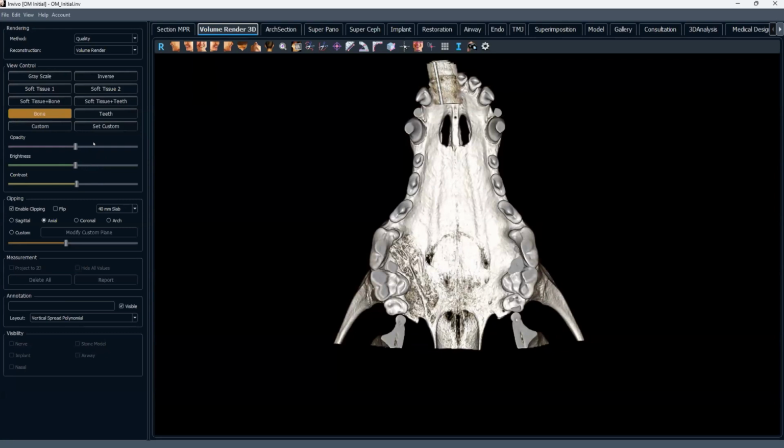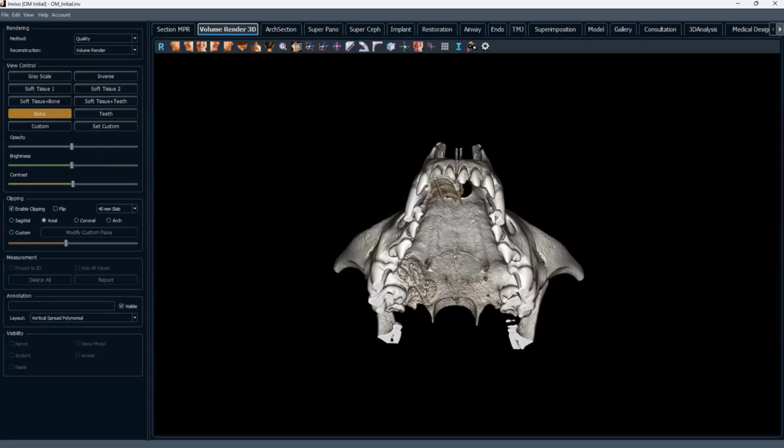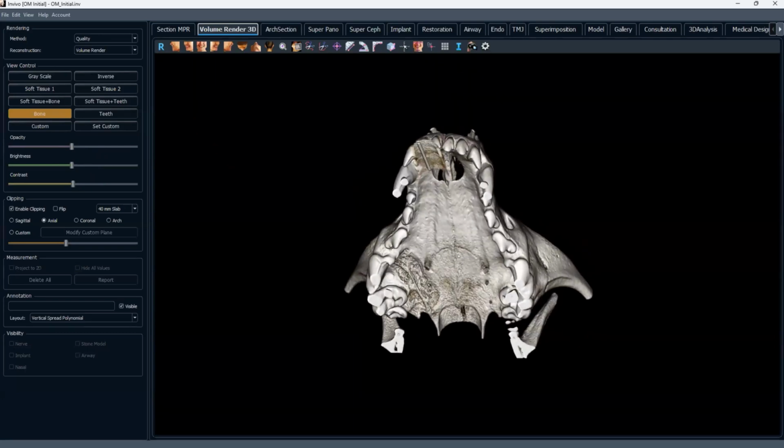And again, this is a cone beam CT, so we really can't tell much of anything at all about the soft tissues as well. Now, for maxillofacial stuff, there's not a lot of soft tissue, so bony margins are often good enough to tell you where to cut. But if you're worried about something that's likely to really invade the soft tissue, then you might need to think about conventional CT. So that's a whole other discussion about when you should use cone beam versus conventional CT. We probably don't have time to get into this evening.